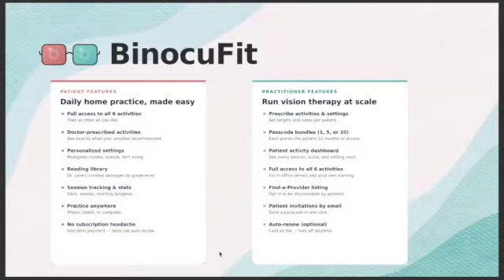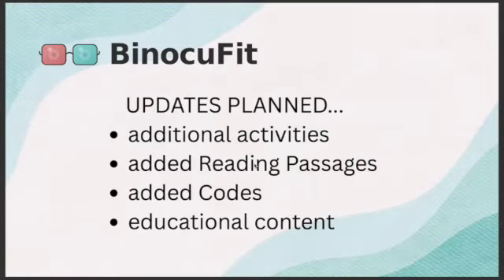Let's see. So I have, because my brain is always thinking and I have a hard time sitting on my ideas without trying to make things happen, I already have another activity in the works that I think you'll like too, but I'm not going to add it for a little bit. I will continue to add reading passages because I really enjoy curating them, and added codes into the BinocuCode. And I also have plans to start producing a little bit more educational content based around how to use this and some of my other things.